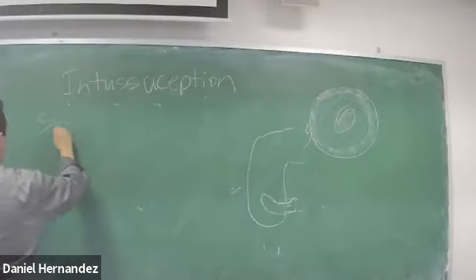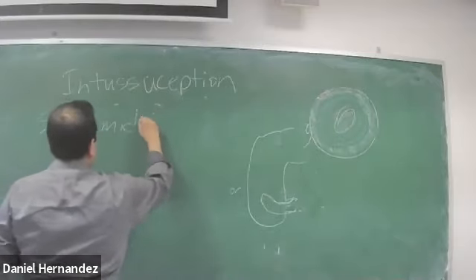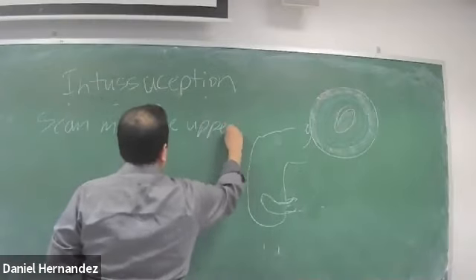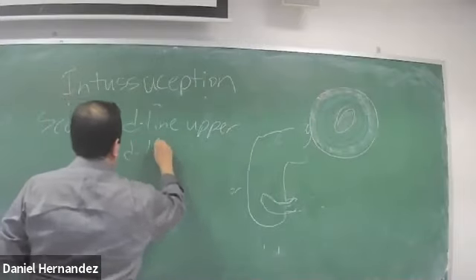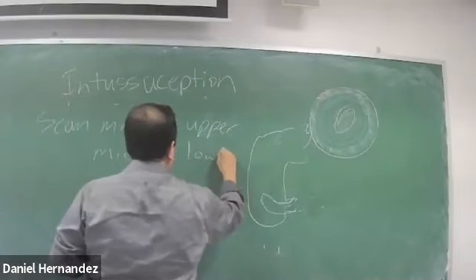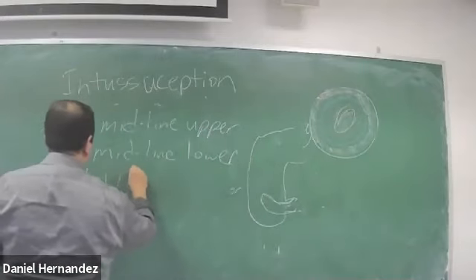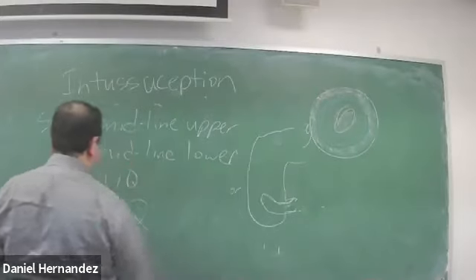So we scan midline upper, midline lower, left upper, and left lower quads.